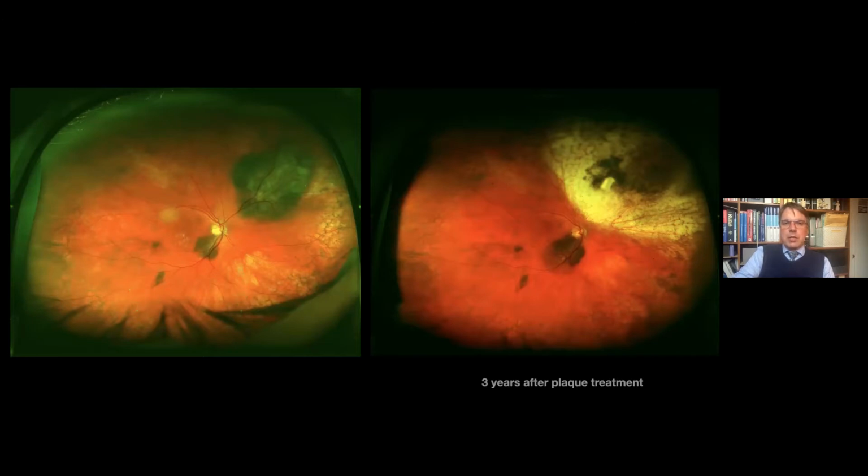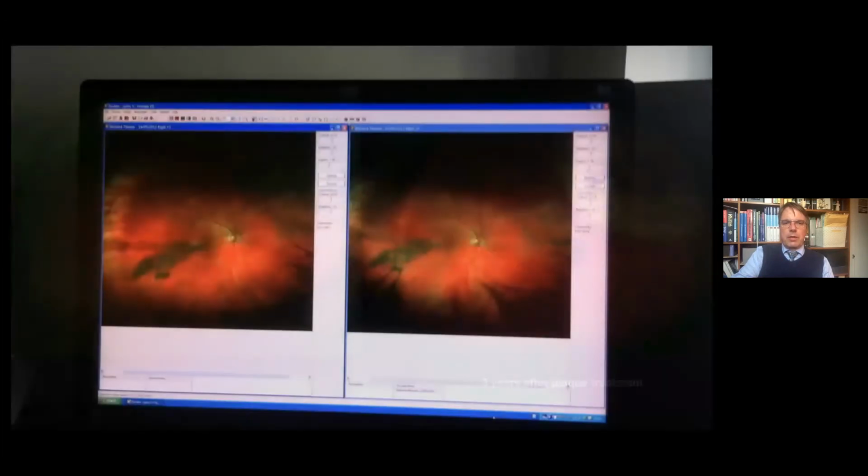What you can also see in the lower part of the eye, some part of the retina is cut off. So it doesn't free you from doing ophthalmoscopy. We still have to, unfortunately, blind everyone with a bright light, because only with the ophthalmoscopy we can look around and see in all corners of the eye.